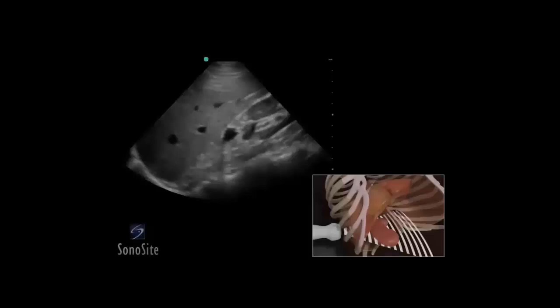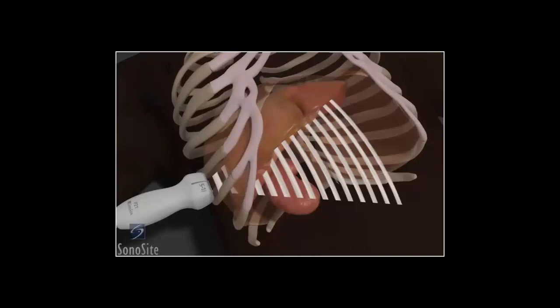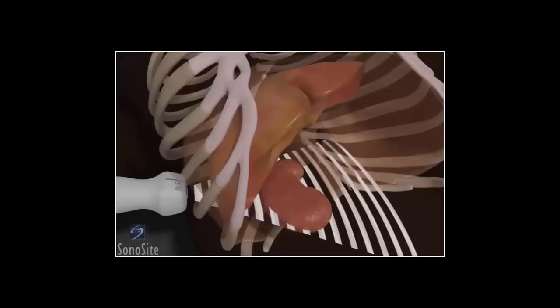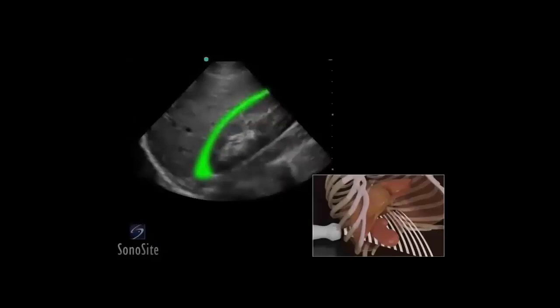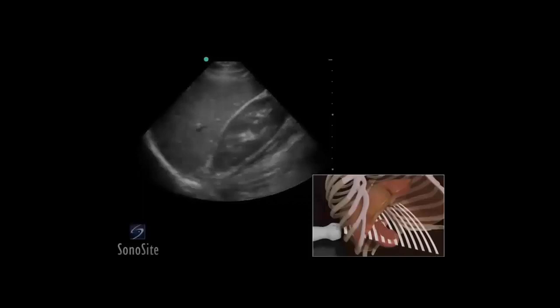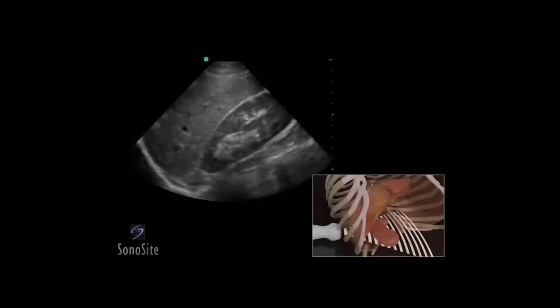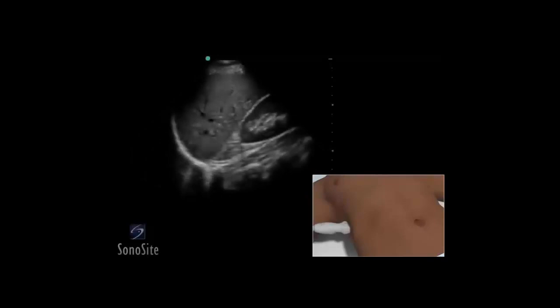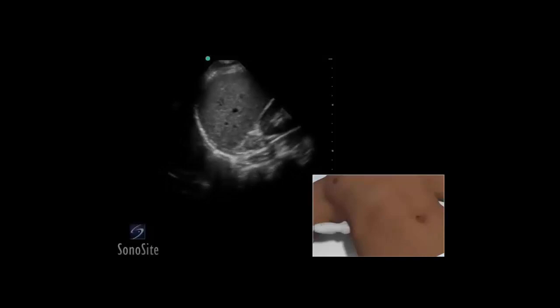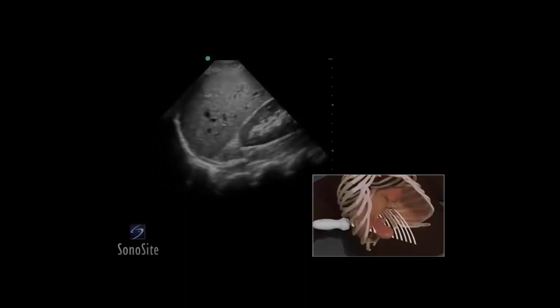A phased array transducer with an abdomen exam type is used to perform the right upper quadrant view of the FAST exam. The orientation marker is directed toward the patient's head. The transducer is placed in a long axis orientation along the right mid-axillary line between the 7th to 9th intercostal space. Rotation and oblique positioning of the transducer will help eliminate rib shadows. To evaluate the entire hepatorenal recess for free fluid, sweep the transducer from anterior to posterior. Fluid will appear as a dark or anechoic stripe between the kidney and the liver. A deep inspiration will move structures down below the ribs for easier access.